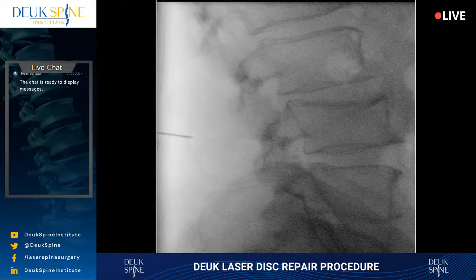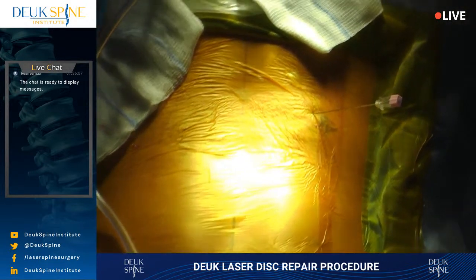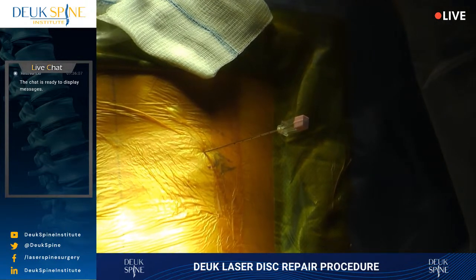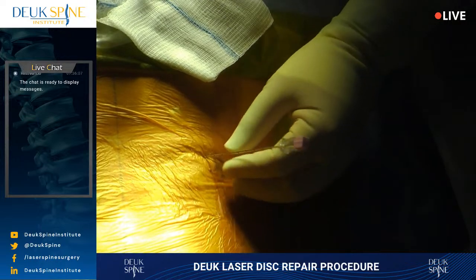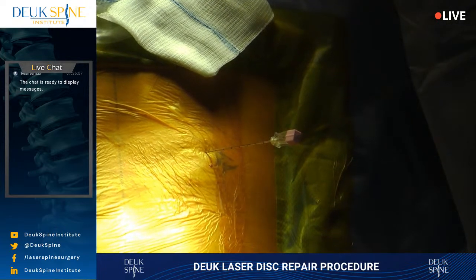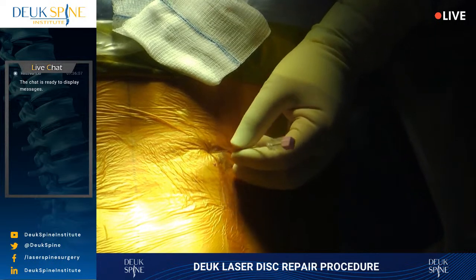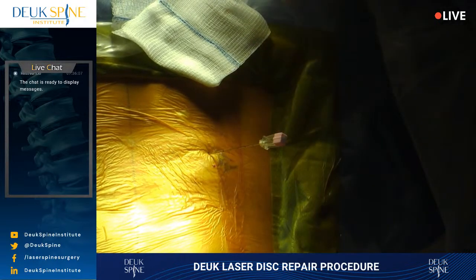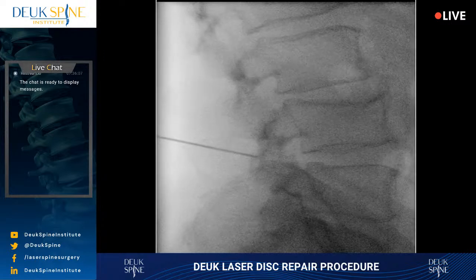Yeah, so Rafferty, it'd be nice if you could make it a little more comfortable. All right, in the very beginning. Well, whatever it takes. I need them cooperative and comfortable. Yeah, you're doing great. Everything's fine. This is the worst part of the surgery in the beginning when you're awake. So the patient needs to be awake. Some people wonder why. Because I need their help navigating to that spot where the pain is coming from. That's why patients are awake.